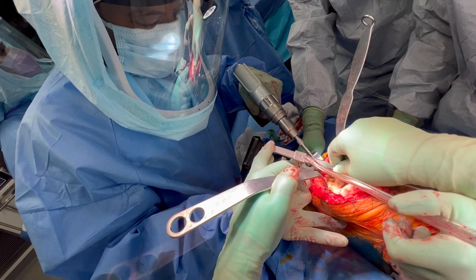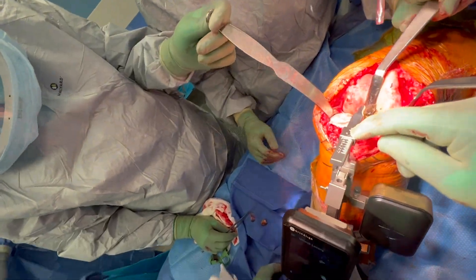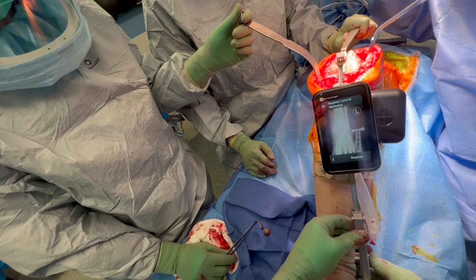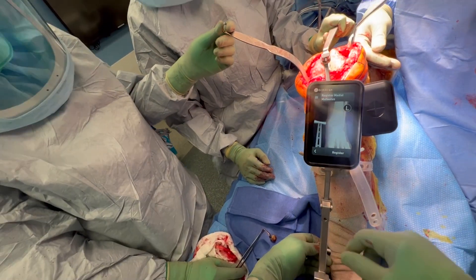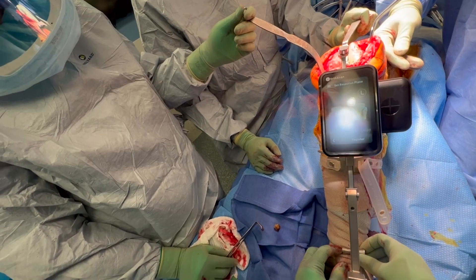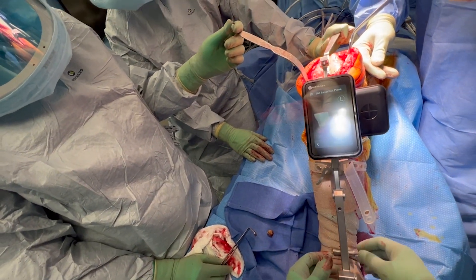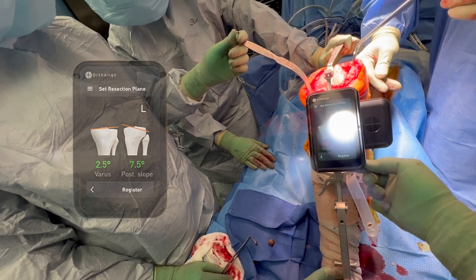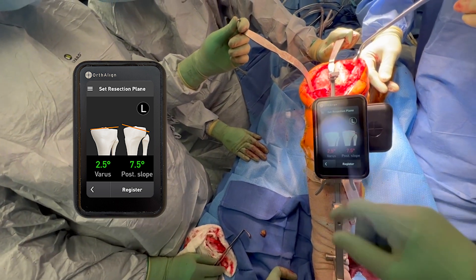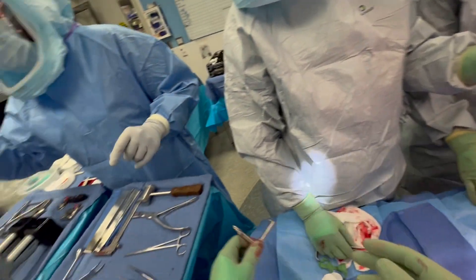We have the tibia exposed. We're putting in the tibial jig, getting everything fixed in place. You match the offset both up at the proximal tibia and down at the ankle. We register the lateral malleolus and the medial malleolus in order to get the center of the ankle — that's how the computer calculates the alignment of the tibia. Then you swing the bar over until you get it where you want it. In this case, I'm planning to make a proximal tibial cut at 2.5 degrees varus and seven-and-a-half degrees of posterior slope to match the patient's native posterior slope.